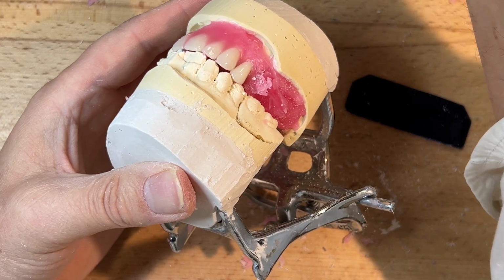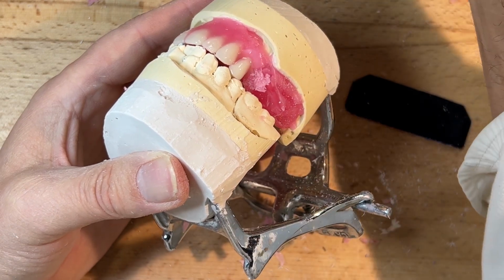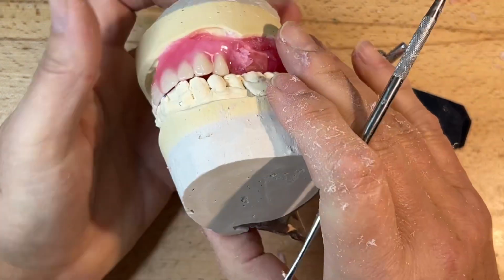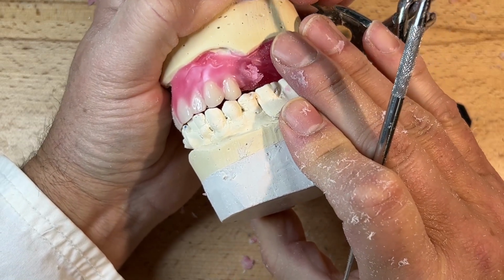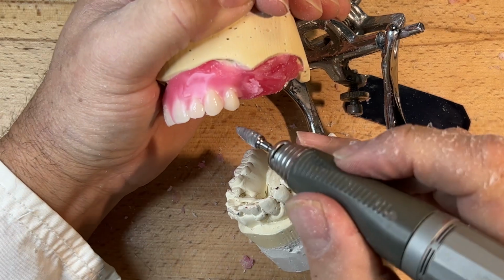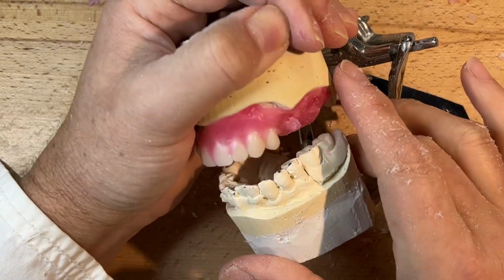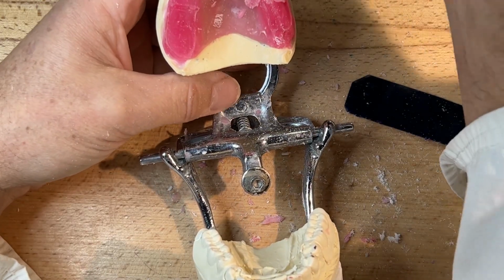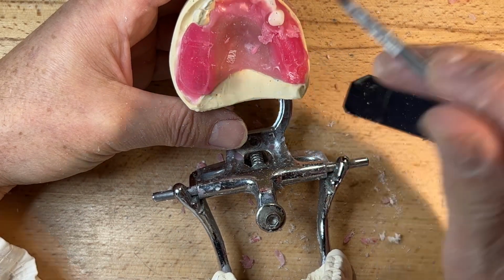And obviously, when the patient is in a lateral excursion, it doesn't have any premature hypercontacts, which we're going to check all of them later. But I can see here that this is pretty smooth. I may reduce the buccal line angle slightly. For those of you who see my big burr in there, I think I'm pretty good. You could use whichever you feel like. This happened to be the tapered burr I had in the handpiece, and I don't feel too uncomfortable with something that size.